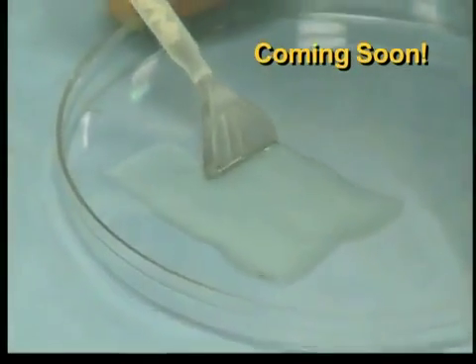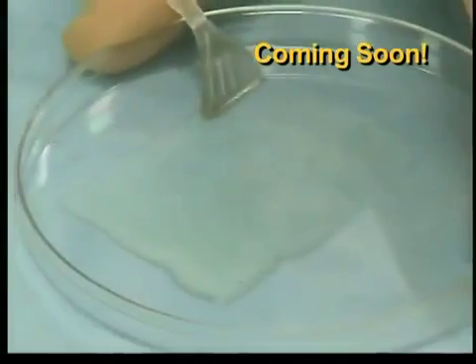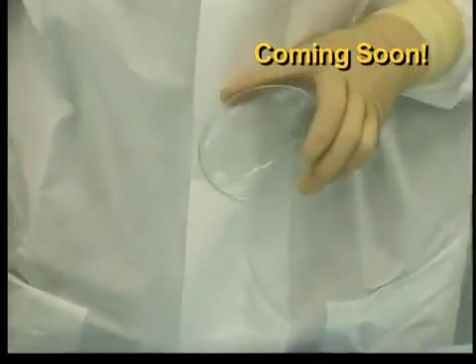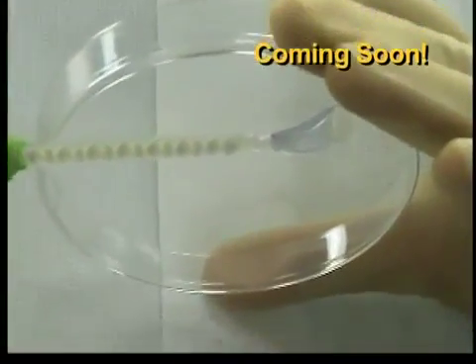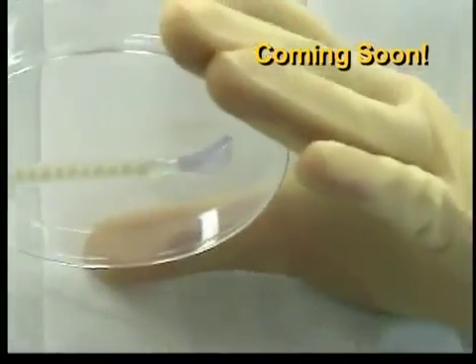The spreader applicator tip allows for symmetrical, thin applications of BioGlue. This makes the spreader tip useful for precise application of the product, capable of obtaining thin BioGlue layers, and effective when sealing a larger area. The spreader tip applicator has a unique feature: it can actually be applied against gravity without dripping.